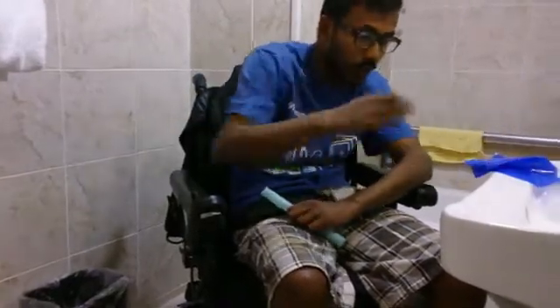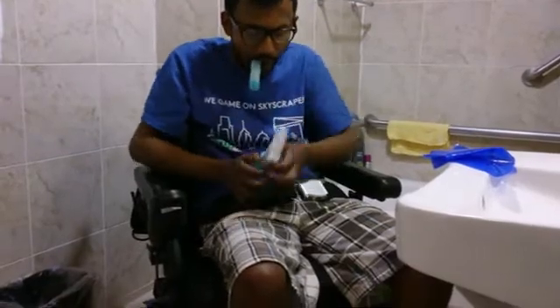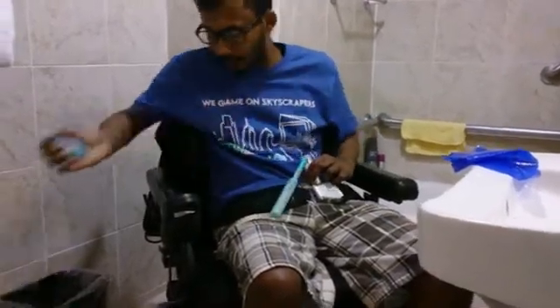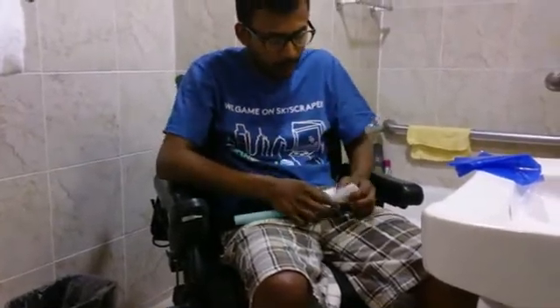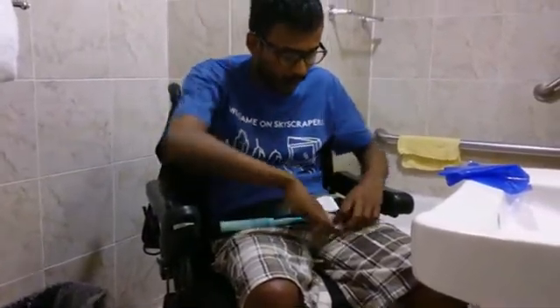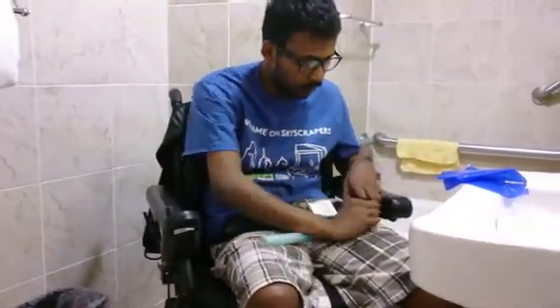I can put the Dyson gripper over here and then throw this in the trash. It comes with a bag — and if I open the bag, it has velcro on it. Even though I have limited dexterity, I'm able to open this.